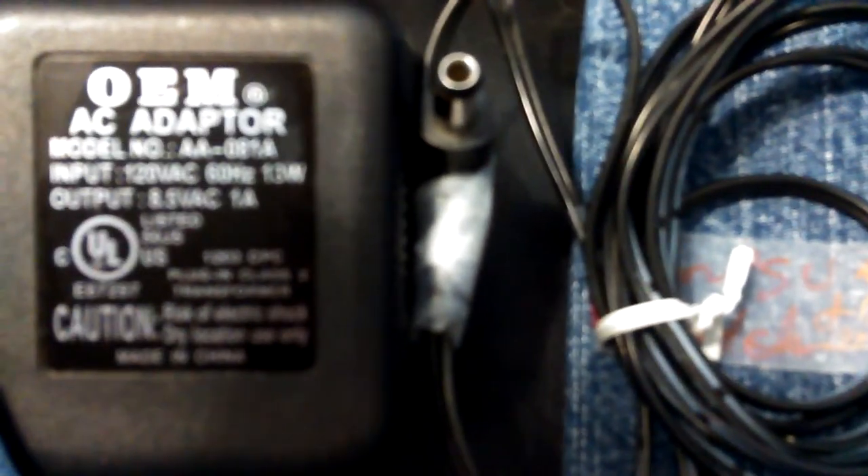That's the connector there on the right. I just got it taped to the wire because it broke off the wire completely, and it either wore out or shorted out because of that.